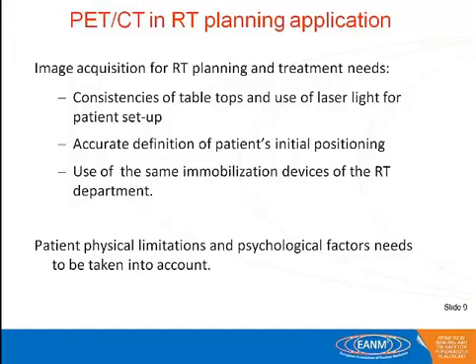Patient physical limitations and psychological factors need to be taken into account. A PET scan lasts from 20 to 30 minutes. It's a long while, and we also have to consider that it can be really stressful for the patient. Physical condition may really change, and sometimes people really suffer from PET-CT for radiotherapy planning. We have to take this kind of problem into account.